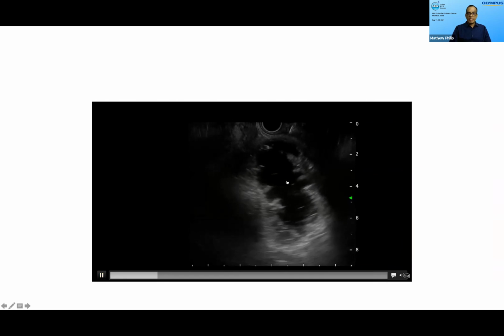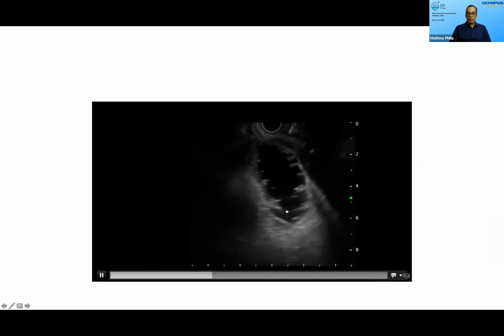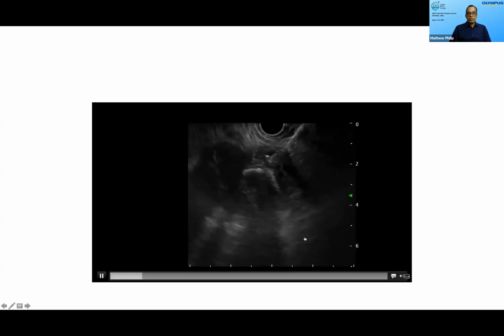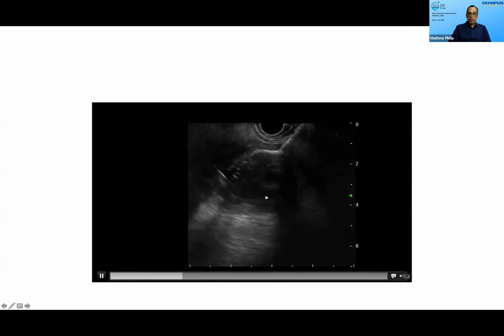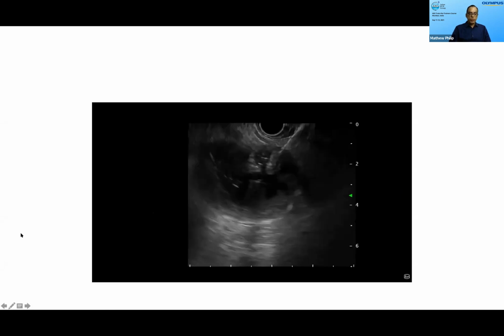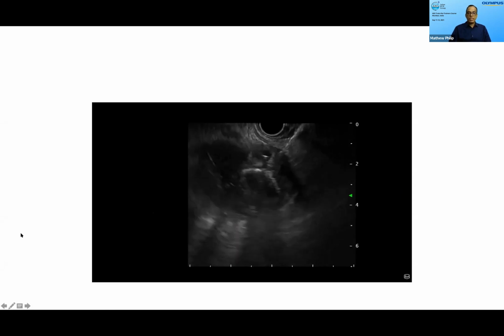If you can actually get a segment like this, it is the best, because there is enough space there, so the delivery system can be well placed. Once you have punctured, then the distal flange is opened up. You can use the fluoroscopy here. Then it is pulled towards the lumen, which we have seen there.